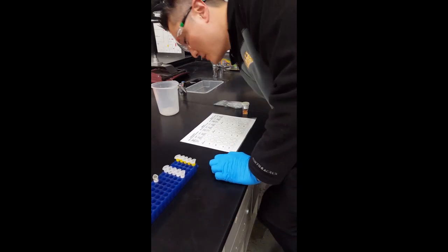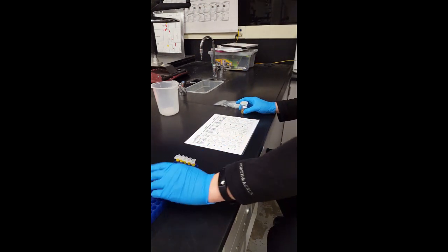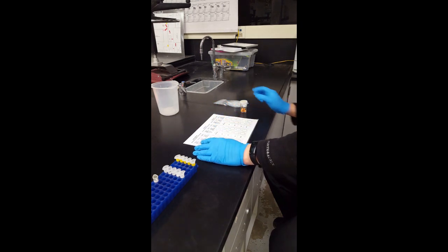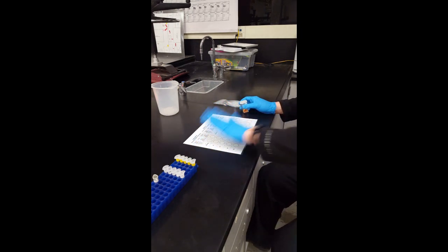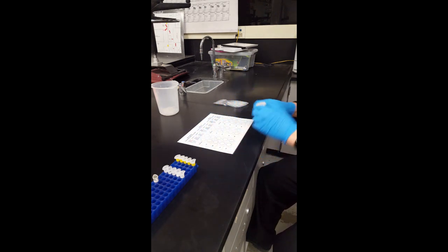Welcome back guys to Don't Be Weak Science. Today we will be doing a glucose and also an insulin test for Ana Garcia, patient A and patient B. So I'm going to demonstrate the procedures for just Ana Garcia so that you can have a good reference on what to do for the lab.